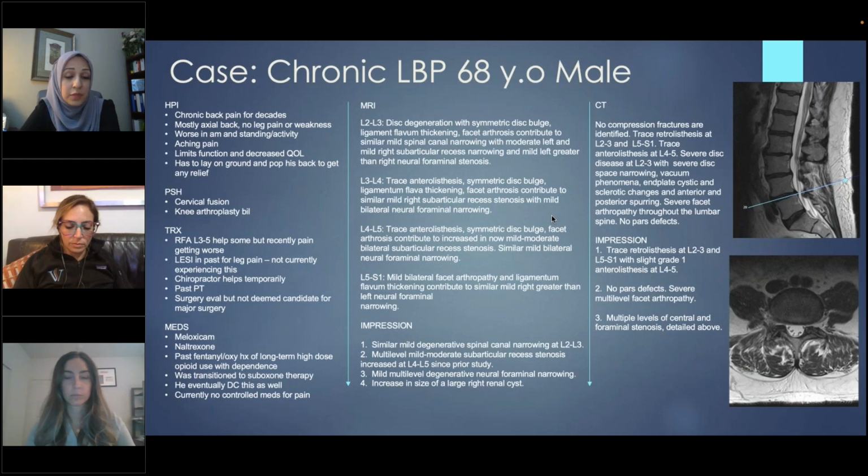He did have pretty bad spine, general deteriorative changes, facet changes, ligament changes, disc deterioration. So kind of a gamut of things that were going on. And as you can see, based on his MRI, plus the CT scan that were done, had some listhesis, quite a bit of severe multi-level facet arthropathy as well.